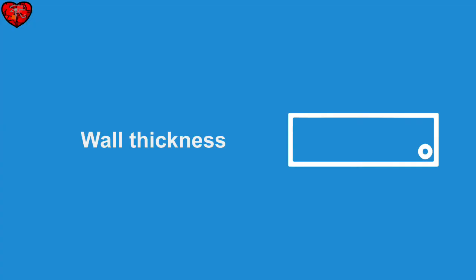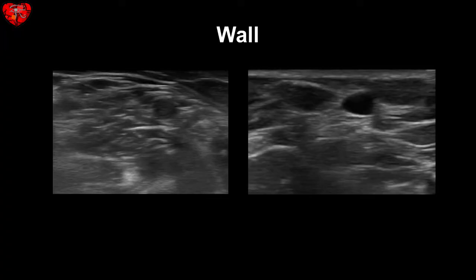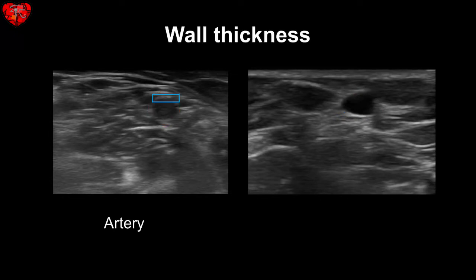Another way to tell artery from vein is looking at their wall thickness. The artery is fairly thick, with different layers in their wall including muscle. The vein has a very thin wall. Here you can see just the thickness of the wall of the artery compared to the vein.